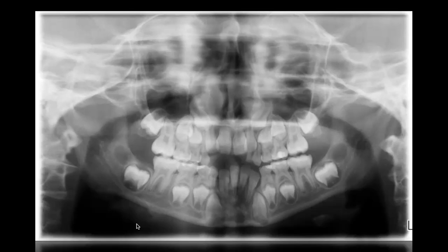Okay, so they look smaller compared to each other, compared to the neighboring teeth. Okay, I would agree. I think that's a good argument for possibly facially impacted teeth because when you look at all the other teeth, especially the premolars, right? The premolars definitely look more magnified compared to the canines, okay? And that could just be that they're big premolars. We don't know. It's a 2D image. But that's at least a good argument, right? The canines are not as magnified as the premolars, so perhaps the canines are more facial than the premolars, okay?